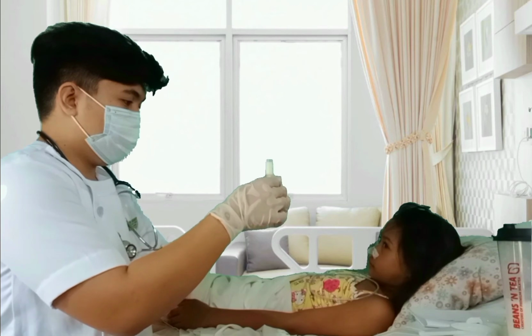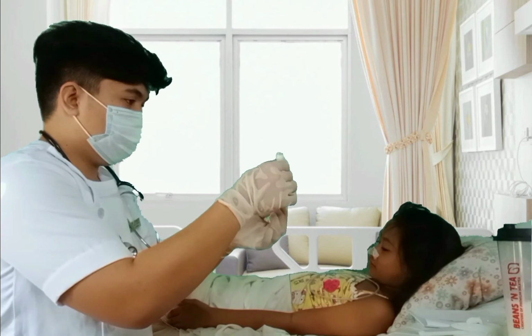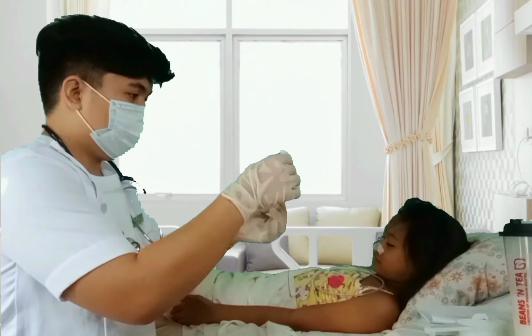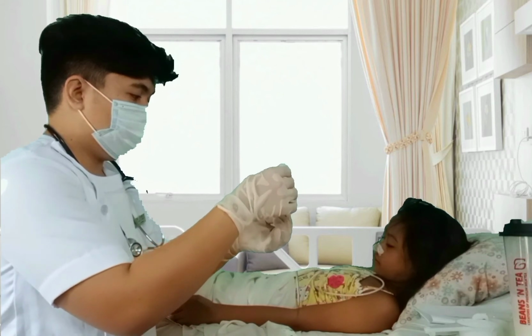Gradual emptying of the tube feeding by gravity from syringe or feeding bag reduces risk of abdominal discomfort, vomiting, or diarrhea induced by bolus or too rapid infusion of tube feeding. Step 7. Advance tube feeding gradually. Tube feeding should be advanced gradually to prevent diarrhea and gastric intolerance to formula.